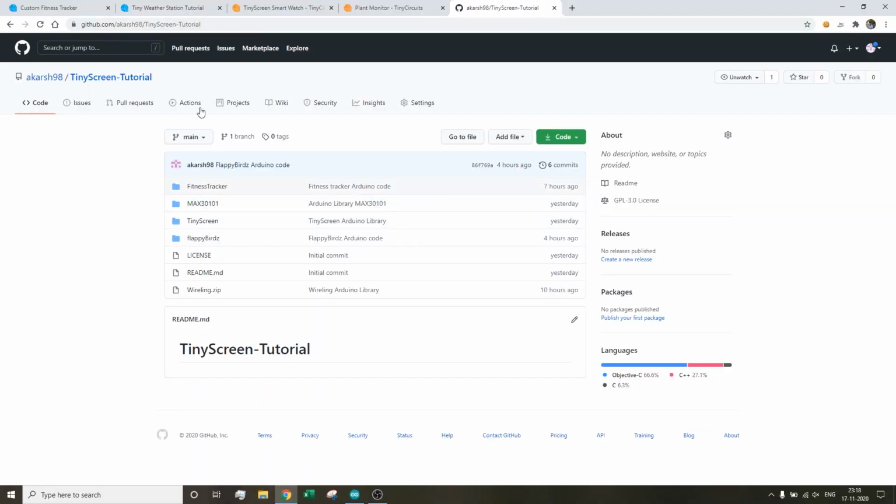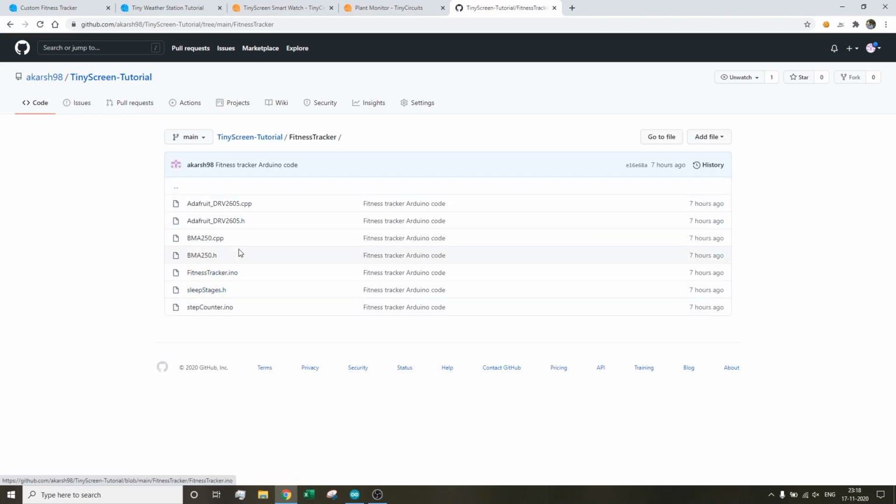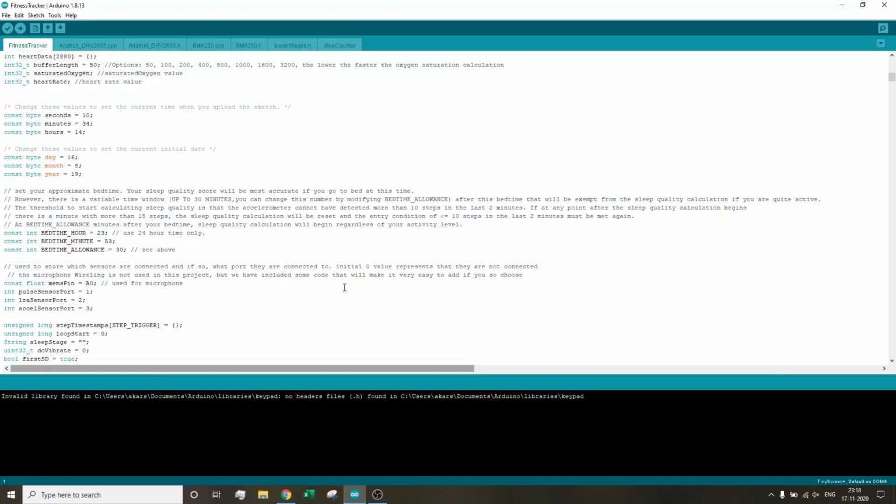So now we need to head to the GitHub page for this project. You need to download the Max30101 library, the Wireling library, and the SD card library, and put it in your Arduino libraries folder. Then you can go ahead and download the fitness tracker code, and that's the code INO file. You need to open it in your Arduino IDE.